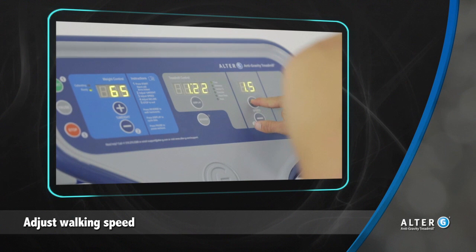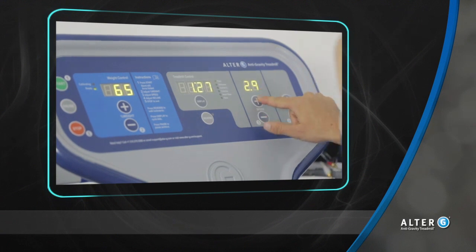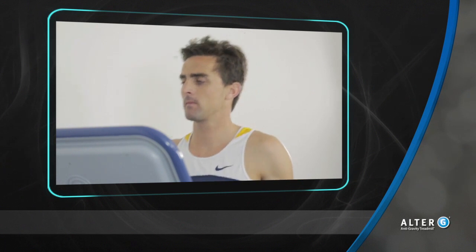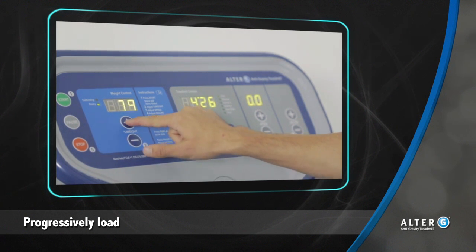Walking speed should be adjusted next, once body weight is set, to help the patient work on mechanics and technique to restore their gait pattern to normal. Once the pattern is normal, progressive loading can take place to help the patient get more comfortable, closer to 100% body weight.